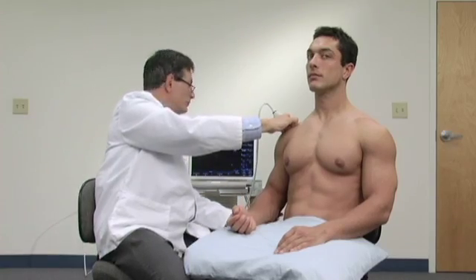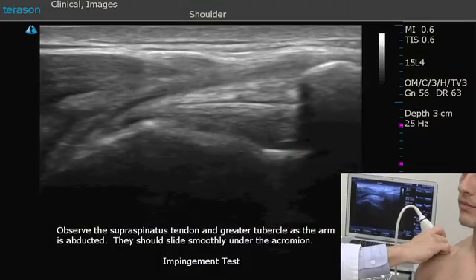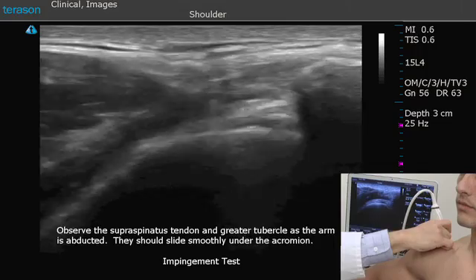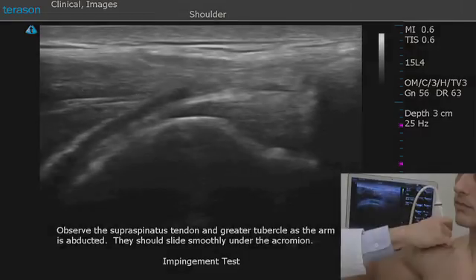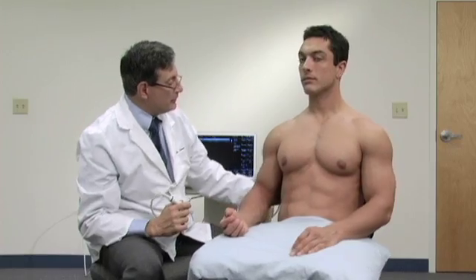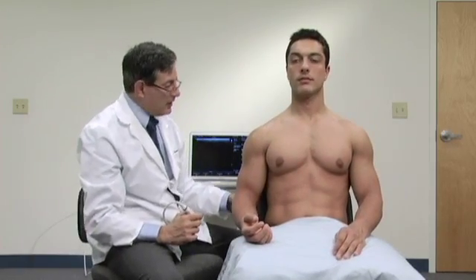We can use this position to look for impingement, so as I raise his arm up, we'll see the sliding underneath — we'll see the tendon sliding underneath the acromion. We're going to look at the supraspinatus tendon, where we see most of our rotator cuff tears. There are a couple different positions that we can use, and the first one I'm going to use is to put him in what is known as the CRASS position.